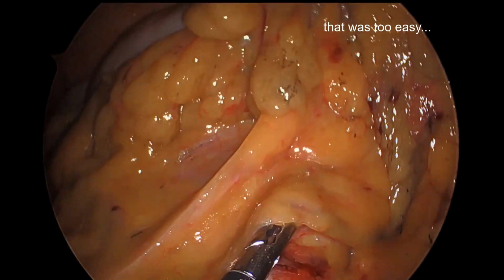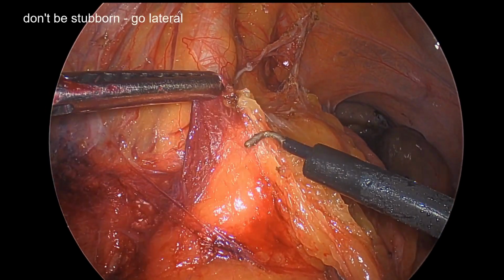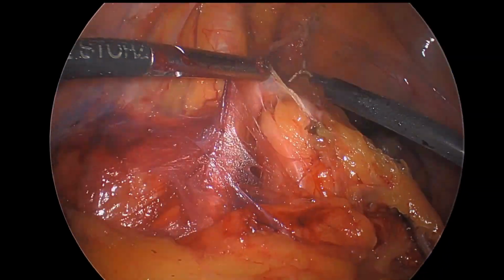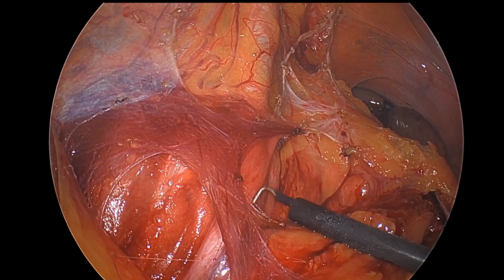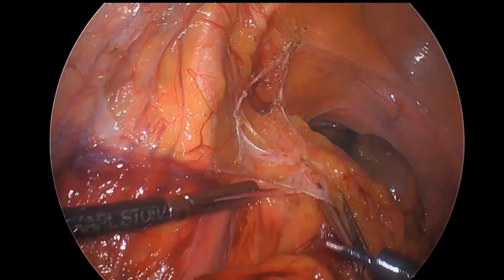So this is the time not to be stubborn, and it's time to go lateral. So here we've gone lateral. You can obviously see we've done a bit more dissection that I've edited out for sake of time. Here we're taking off all the remaining lateral attachments. You can see the ureter there, and you can see these sidewall attachments.